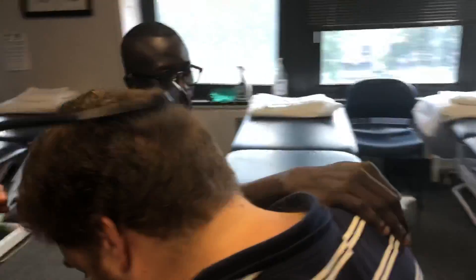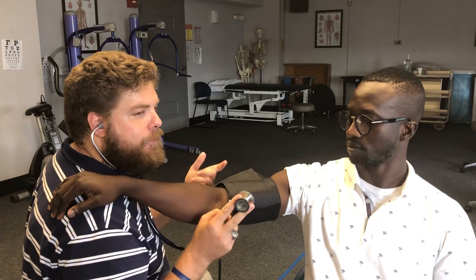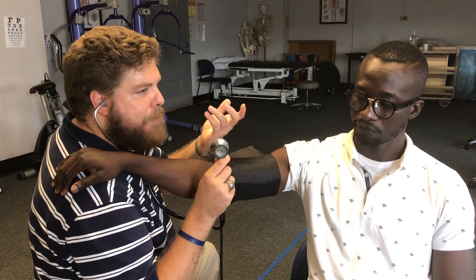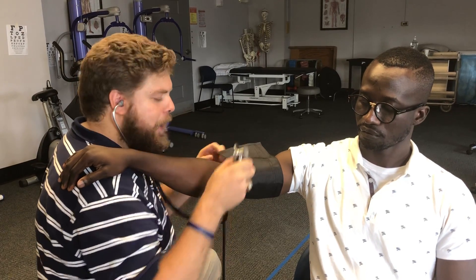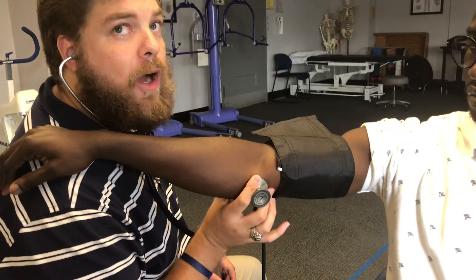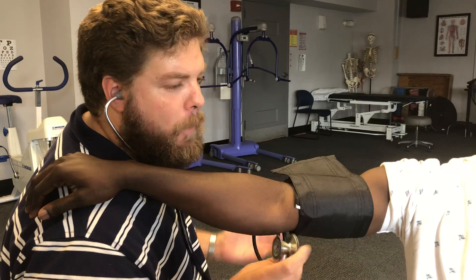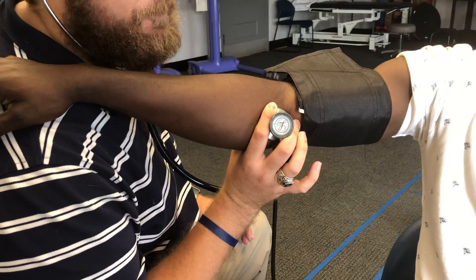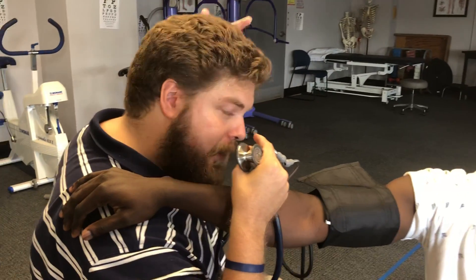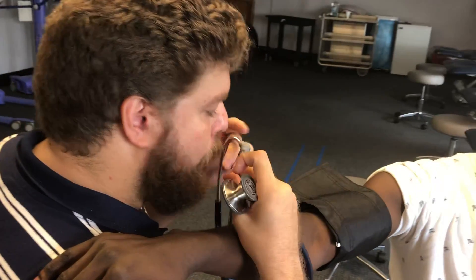When we're inflating, first thing we always want to do is check that our stethoscope is on. Give it a nice light tap — if we hear the sound amplified, we know it's on. If it's off, you'll hear a tap but it won't be amplified. This is basically just a very low-tech microphone. When placing our scope, I always use a peace sign grip. This prevents us from using our thumb and gets you into good habits. Your thumb may potentially produce its own pulse, which could affect your reading. Also, always make sure your stethoscope earbuds are facing forward — your acoustic meatus in your head is aligned this way, so if you place it the wrong way you won't propagate those sounds effectively. Pointed towards your nose is the easiest way to remember.